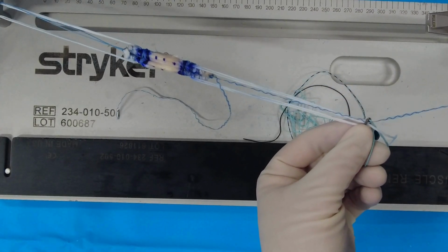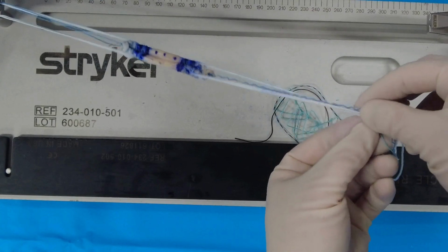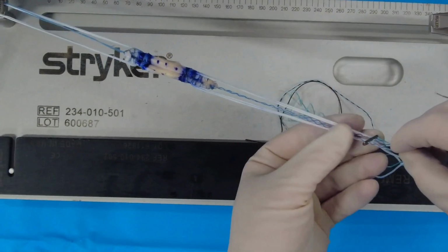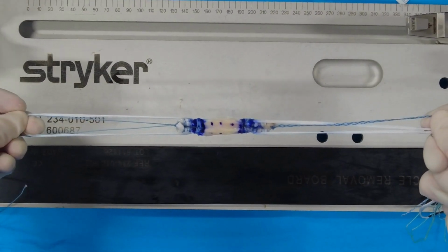And I do use a knot pusher to tie these on the femoral side at the end of the case, where final tightening is done with the suspensory so that the tension is felt through the suspension at that length stable position. And here's the final product ready to pass.